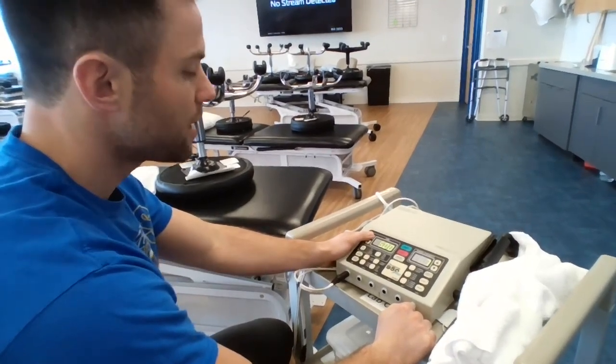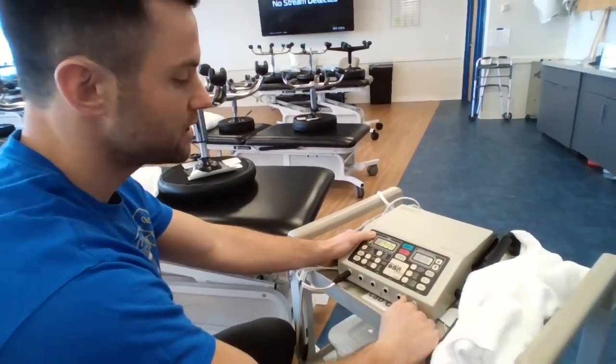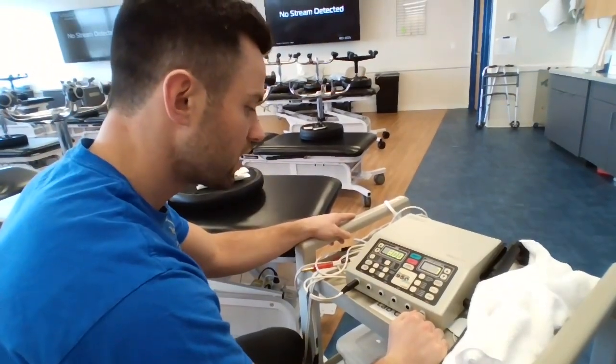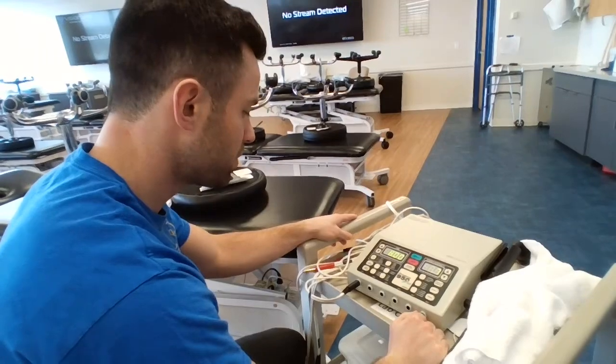And for time, we're going to go somewhere between 5 and 10 minutes. I'm just going to go 8 minutes with Ronnie. And looks like we're all good and set up on the machine. So now we're going to talk to Ronnie.